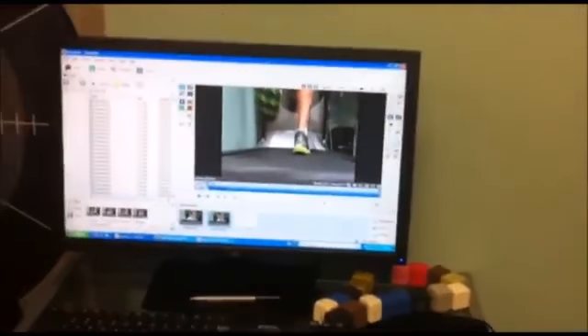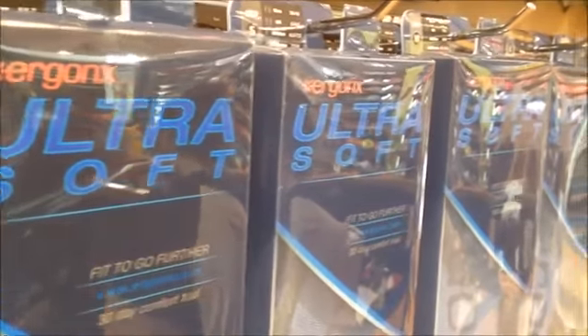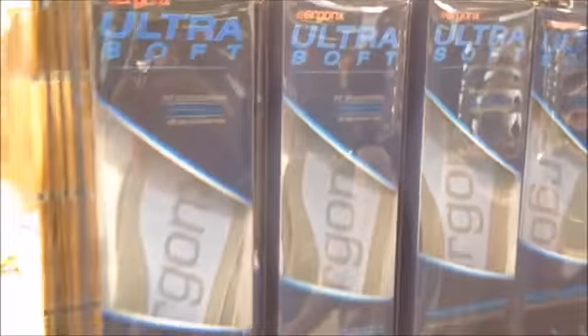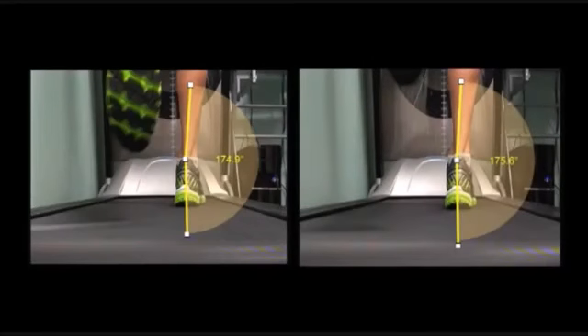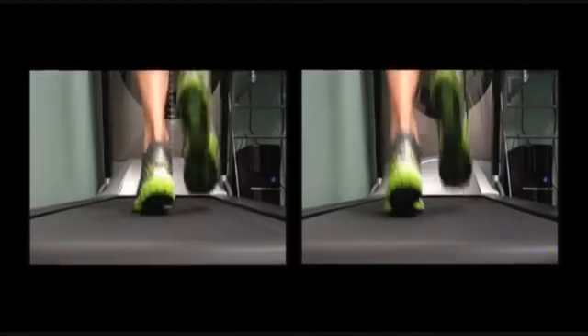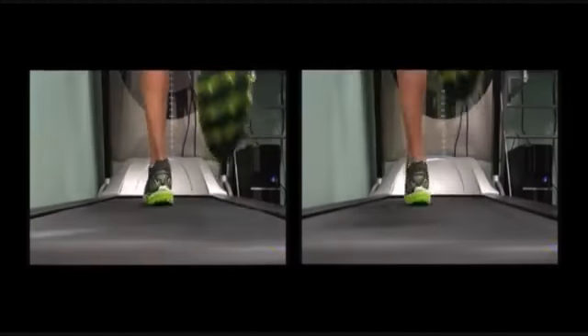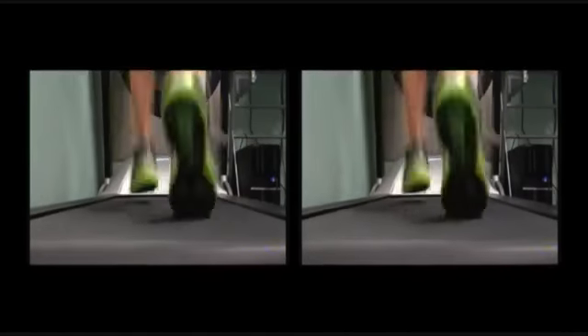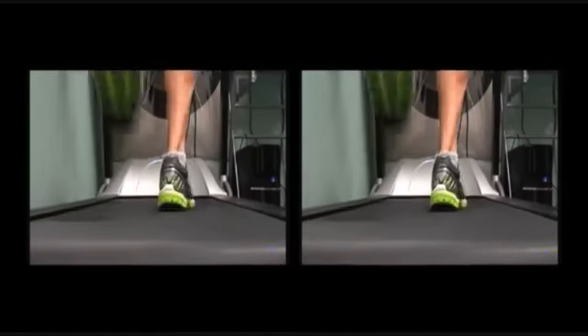On this occasion we use the ultra soft inner sole because it is 0 degrees wedged and helps to support the calcaneal inclination angle, controlling overpronation without overcorrecting the foot. The right hand image shows a shoe fitted with an ultra soft inner sole. You'll notice that the overall amount of pronation has been reduced to 4.4 degrees, which is very close to a normal amount of pronation.